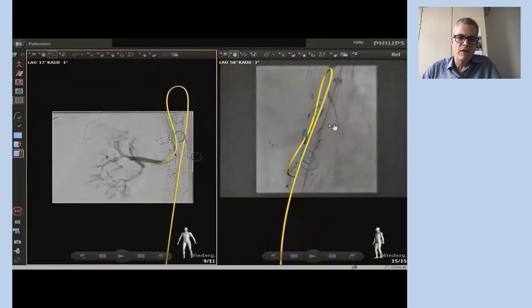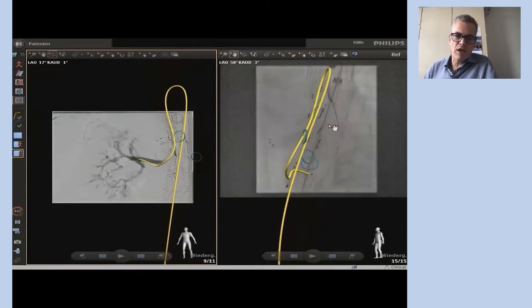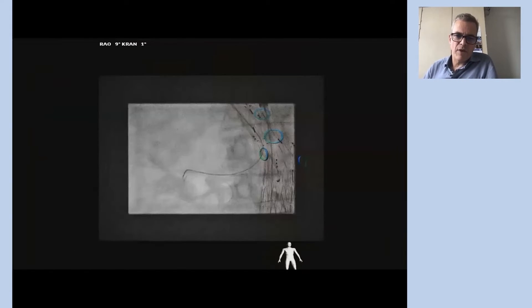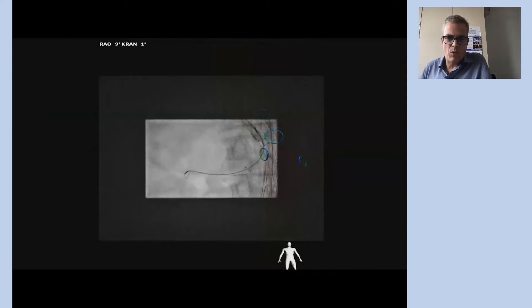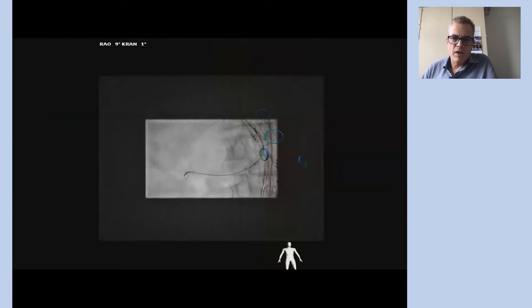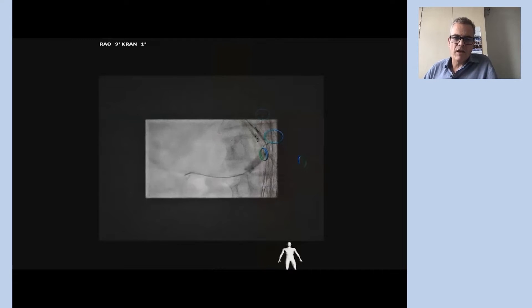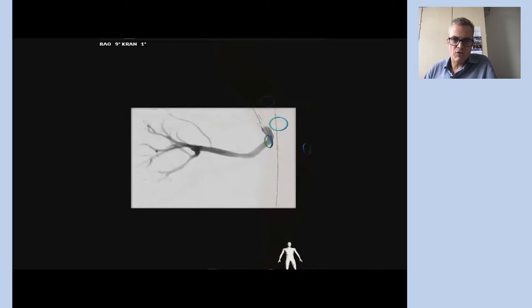This already depicts the right renal artery, which is accessed using the FORCE wire, and after deployment of the bridging stent and dilatation using a standard PTA balloon, the selective angiography shows a good result for this target vessel.